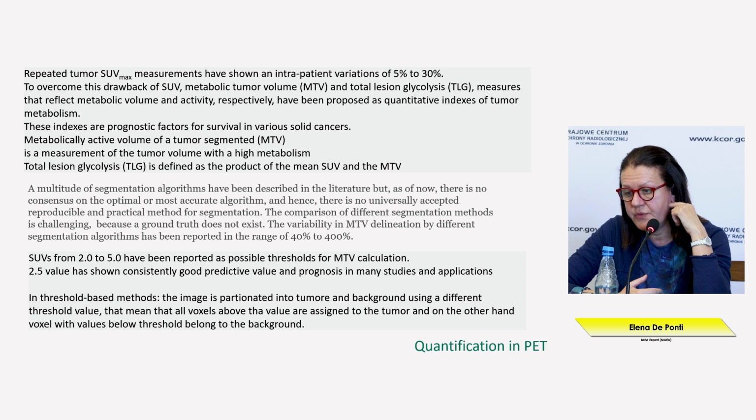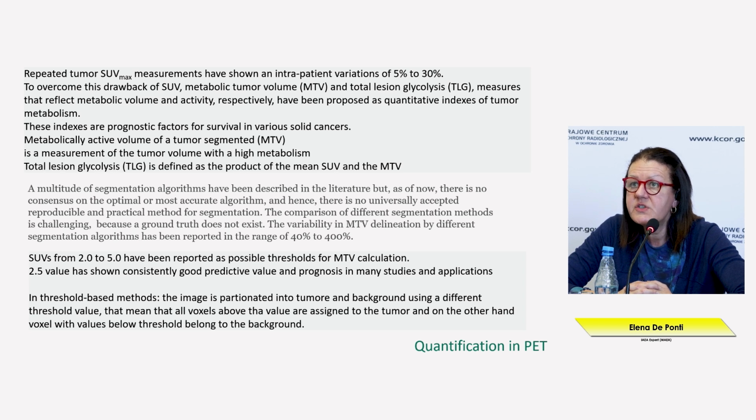The problem with this kind of metric in oncological application is the choice of a way for segmenting the tumor. In literature we can find many papers providing evidence that one method is better than another, trying to establish which is the best, but it depends on the kind of application that we are going to use the MTV for.